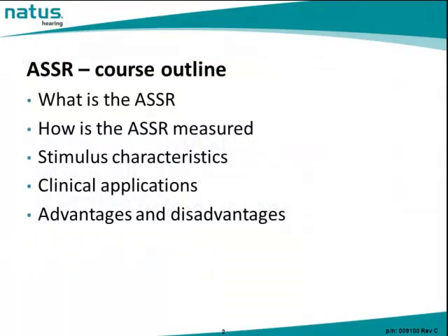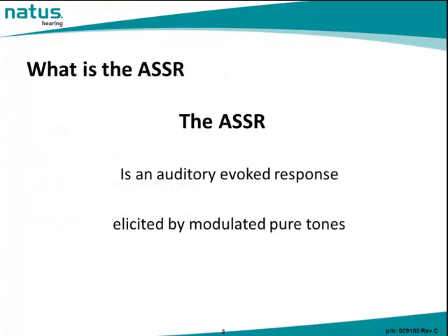In this brief introductory presentation, we will cover what the ASSR is and how it is measured. We will review stimulus characteristics, and we'll discuss clinical applications including advantages and perhaps disadvantages to including ASSR in your clinical test battery. The ASSR is an auditory evoked response which is elicited by modulated pure tones.